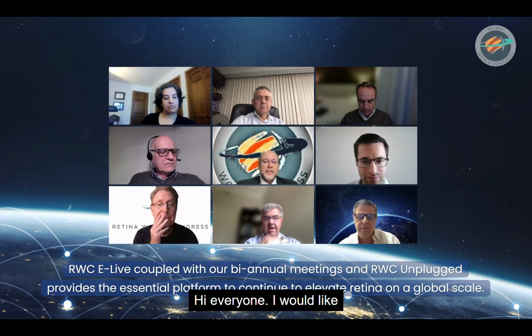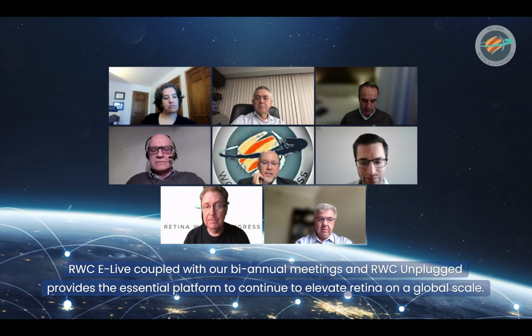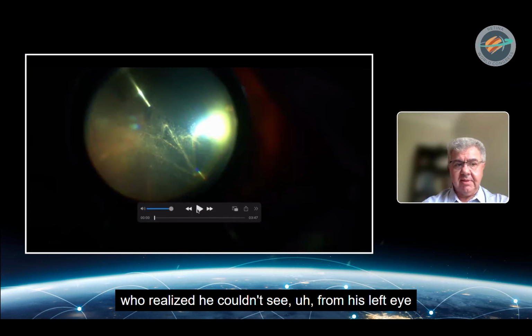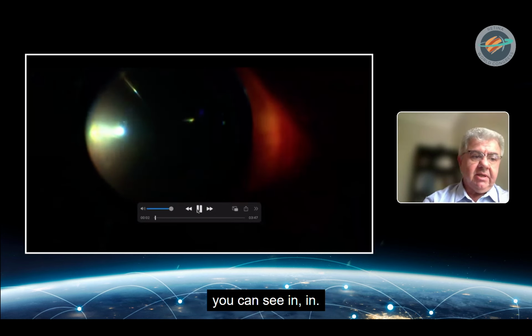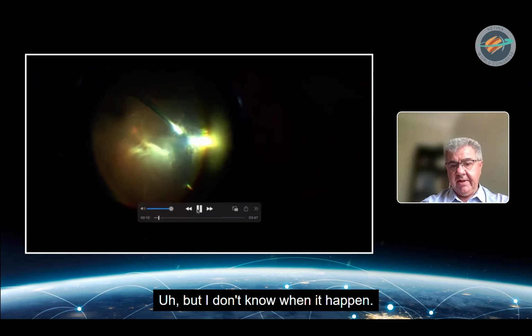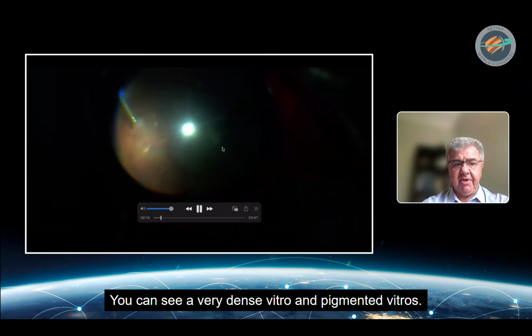Hi, everyone. I would like to thank the event organizers for inviting me. It's an honor to present in front of you today. This is the case of a 25 year old man who realized he couldn't see from his left eye after suffering a trauma on the right eye. You can see in the video a very old retinal detachment, but I don't know when it happened. You can see a very dense and pigmented vitreous.